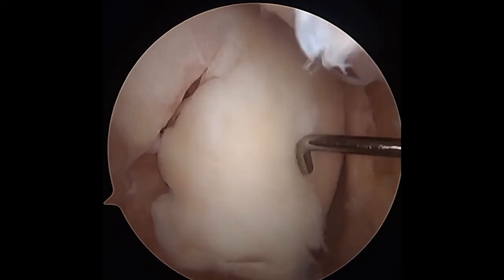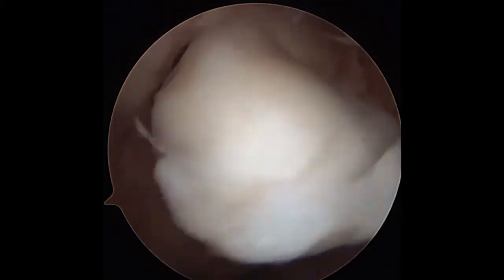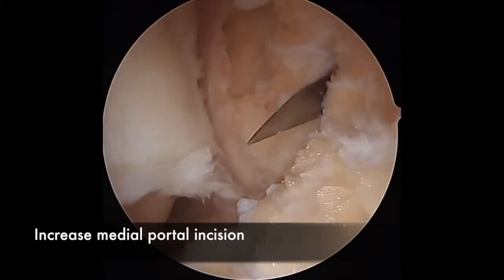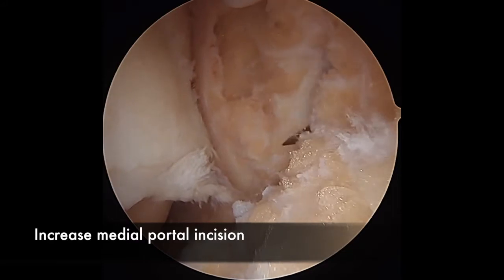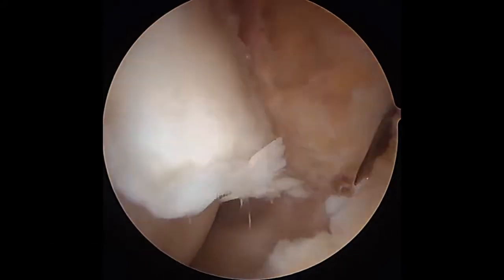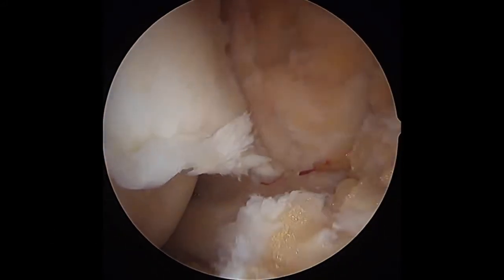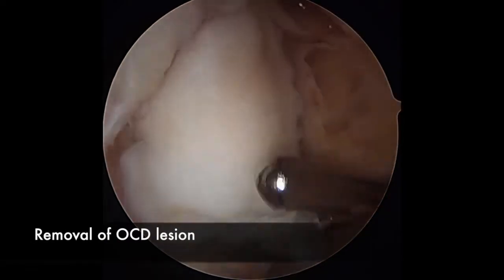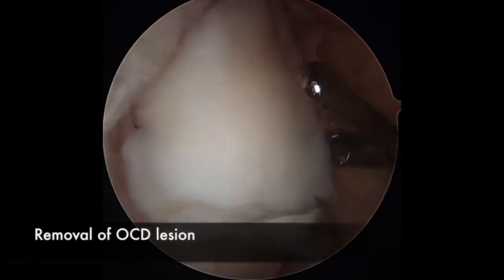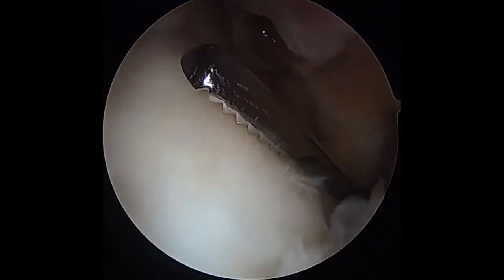The defect measured 3 by 2 centimeters. The medial portal size is increased with a scalpel for removal of the OCD defect, which is then removed using graspers. The lesion was confirmed to be 3 by 2 centimeters.